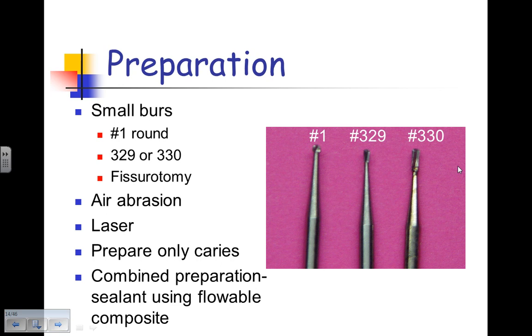Once our preparation is completed, our restoration will be an etch and rinse adhesive with a flowable composite that will act as a restorative for the preparation and a sealant over the entire occlusal surface.